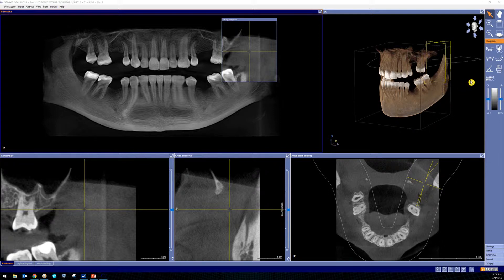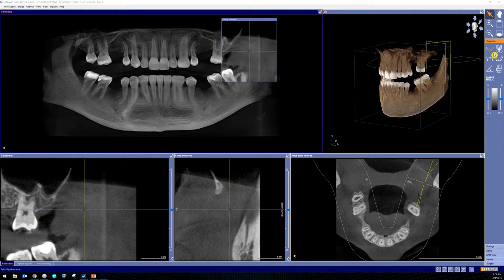On the right-hand side, any time you open up the implant software, you're going to have Diagnosis up top, followed by Findings, Nerve, CAD CAM, Implant, and Surgery in the lower right-hand corner. Diagnosis is where we want to be to adjust the curve. To do that, we hover over the jaw-shaped icon, which will then turn orange, and we'll click on it.